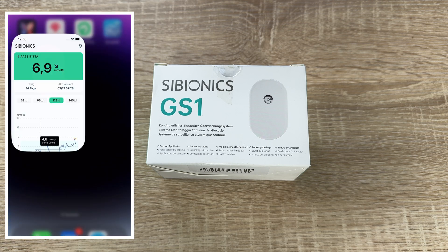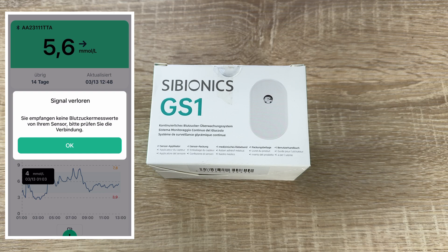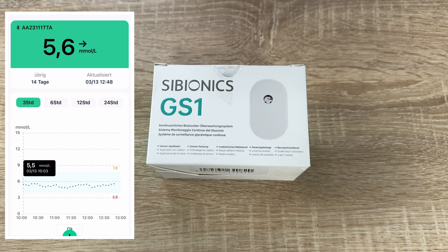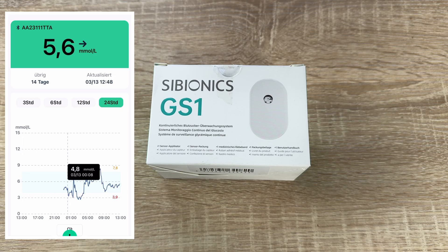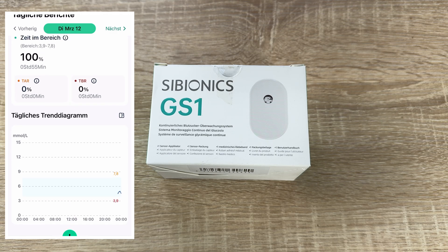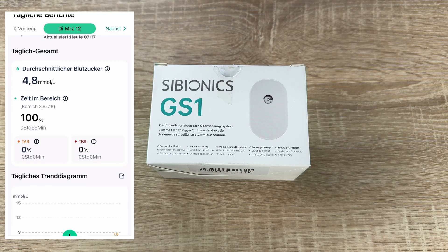A CGM is a device used for monitoring blood glucose on a continual basis, instead of monitoring glucose levels periodically by drawing a drop of blood from a finger. This is known as continuous glucose monitoring.